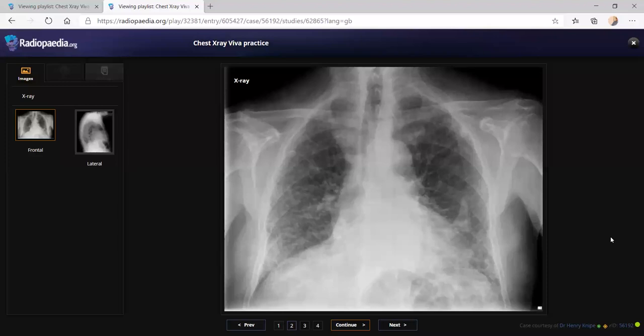There is no previous radiograph available. Okay. So I like to go for the occupational history of the patient if available, and if the patient has a significant occupation. Can you derive any occupational history from additional findings in the film?